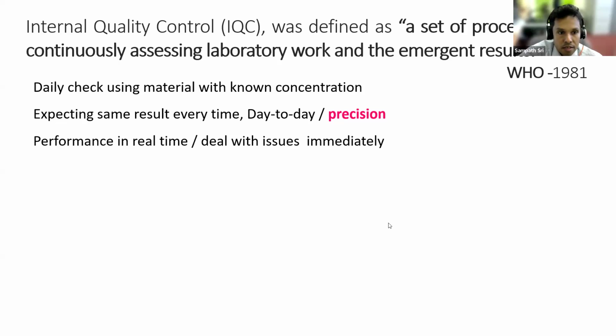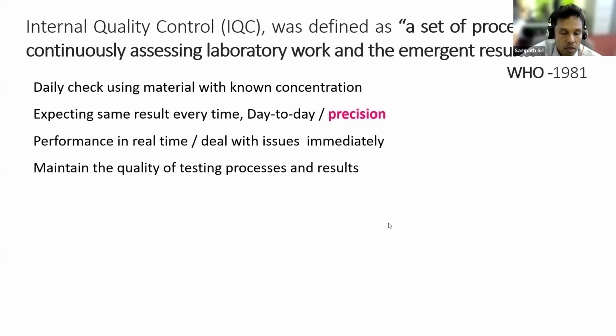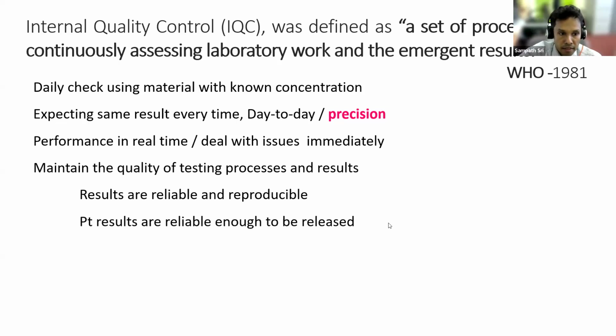This performance is real time, so we can deal with issues immediately. With IQC, we can maintain the quality of the testing process and its results. We can make sure our results are reliable and reproducible, and it helps us release patients' results reliably.